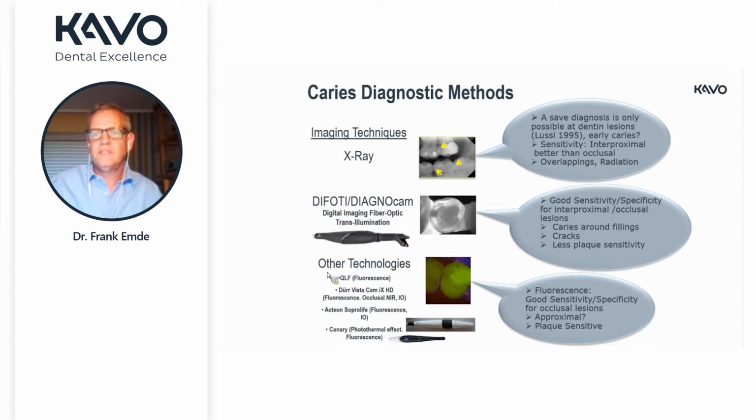Just to avoid questions, yes, there are other technologies coming on the market. We've seen that last year and this year, especially devices which do dental 3D scans. These cameras are also added sometimes, like the Trios from 3Shape or the Planmeca Emerald. They are also added to transillumination possibilities.